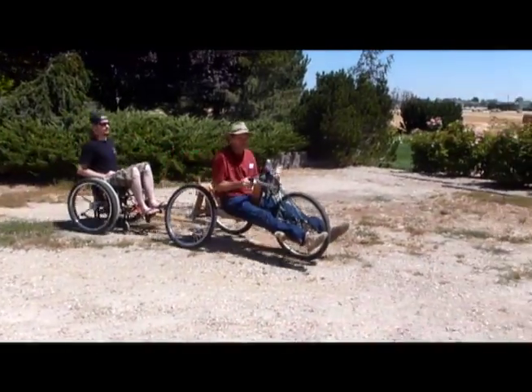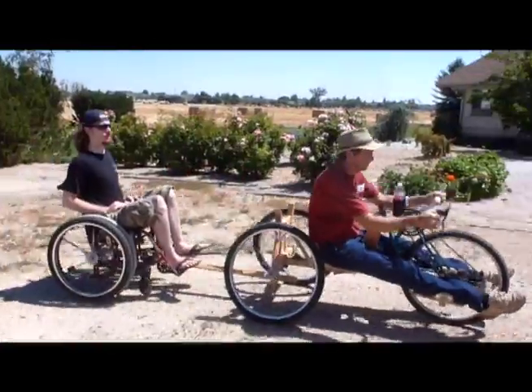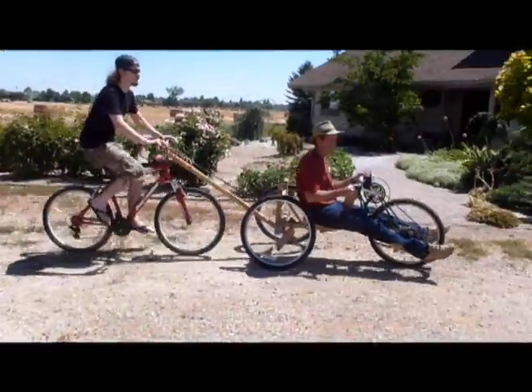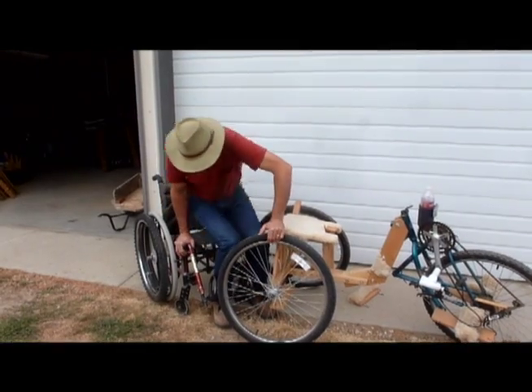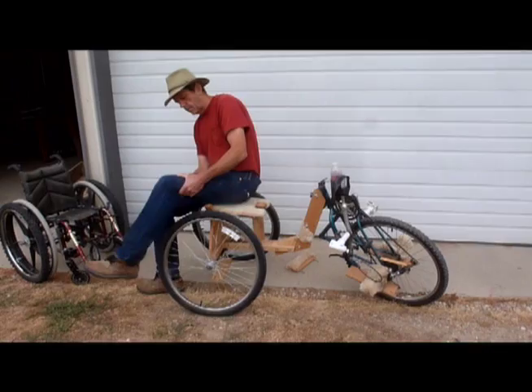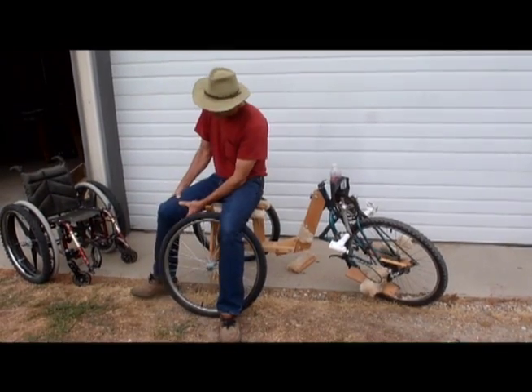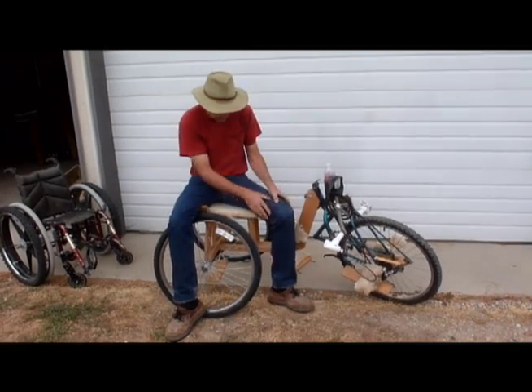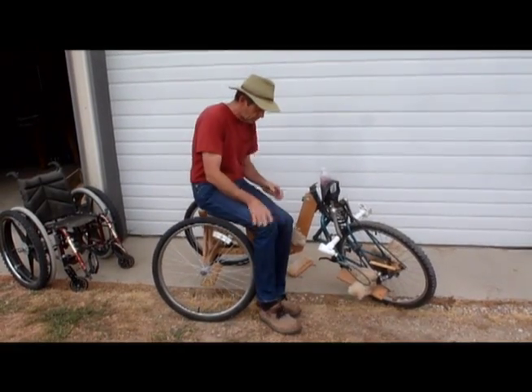With the addition of a buddy bar, you can bring a friend along or have them help with long uphill stretches and stopping. Independently transferring from your wheelchair and then to the riding position may seem complicated at first, but after a few times it becomes quick and easy using the seatbelt and the hinged seating system.